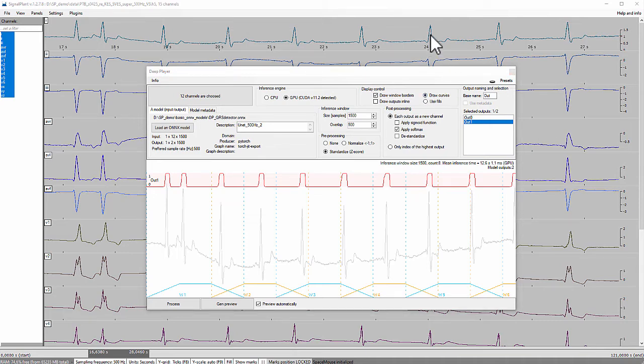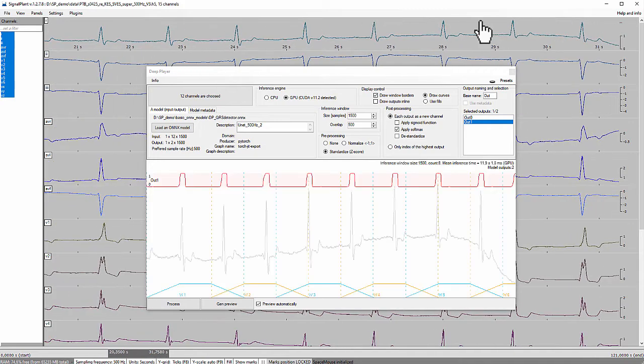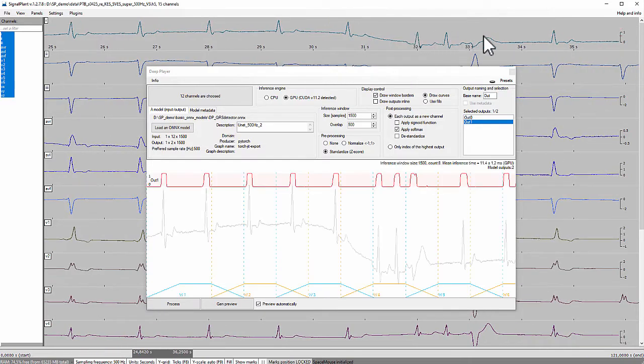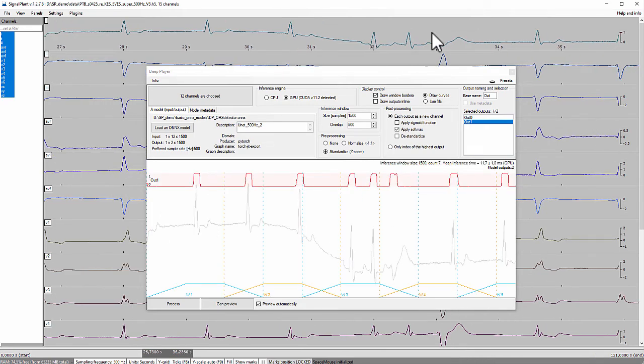And now I can check whether this model would work even on premature contractions. Let's find them. It should be more to the right. Here we are. Oh, that's fantastic. My colleague did a good job. She prepared a very good model.